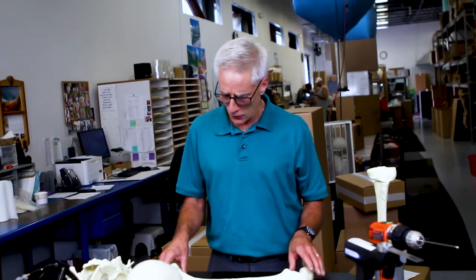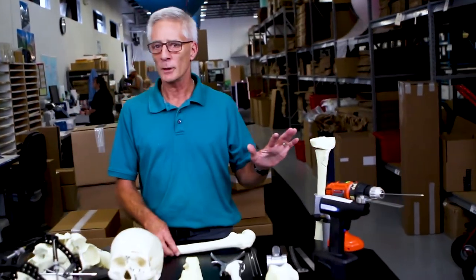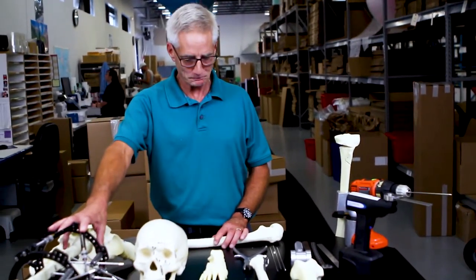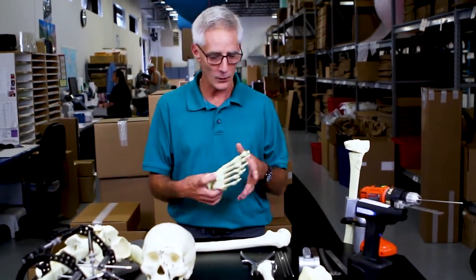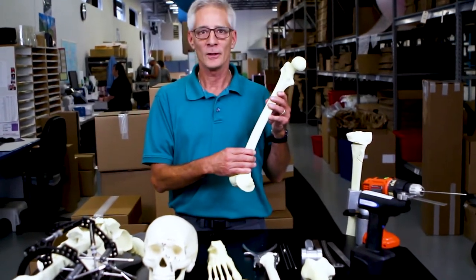The sales reps and residents in teaching and training all use these products to demonstrate their products, practice skills, and to do general anatomy, which these are very useful for. They're economical, they're readily reproducible, and they're always available.